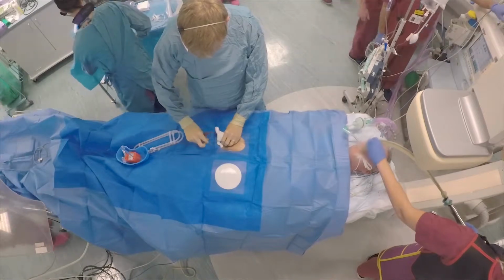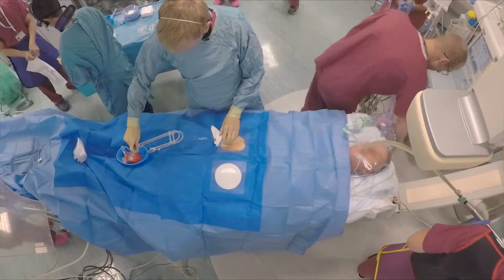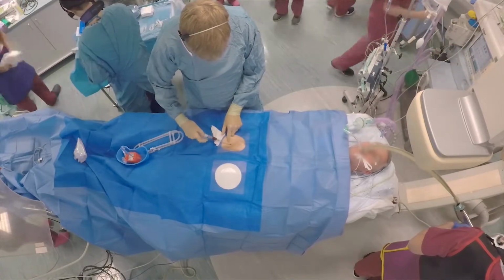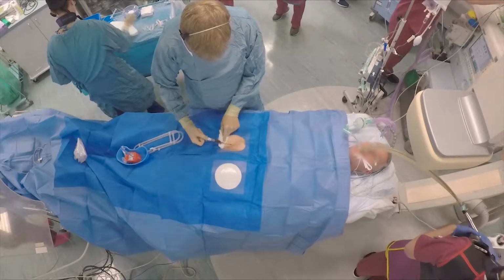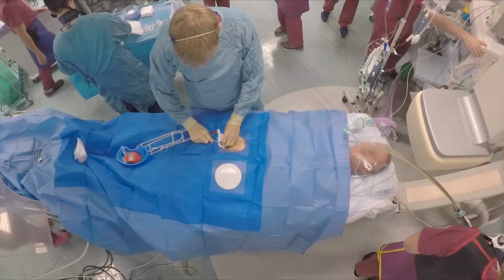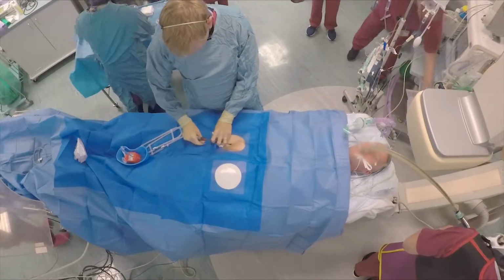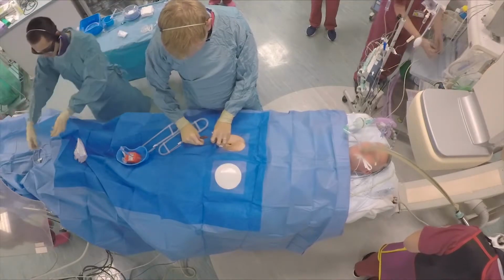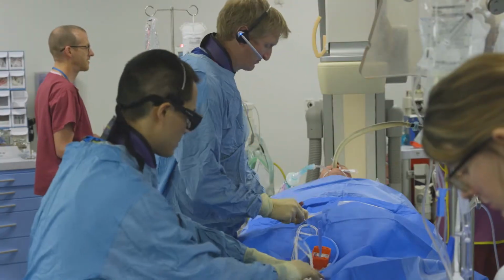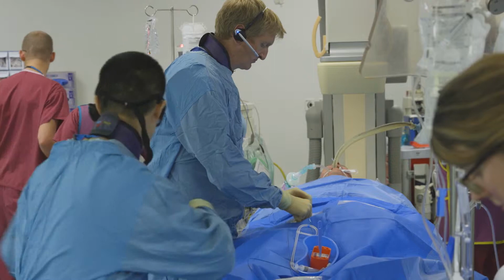One of the things that should be stated is that the more you analyse your data, the easier it is to analyse individual points and get better at each single step. I view an AF ablation as a number of steps. Right now, I'm expecting that to get from needle to left atrium and start making the map will take less than 10 minutes.